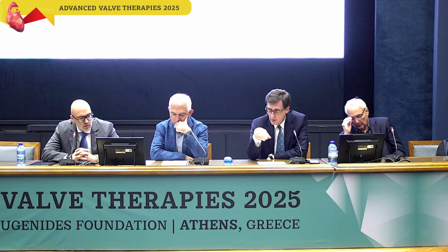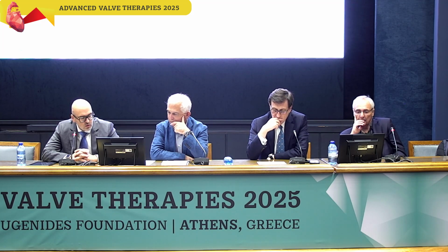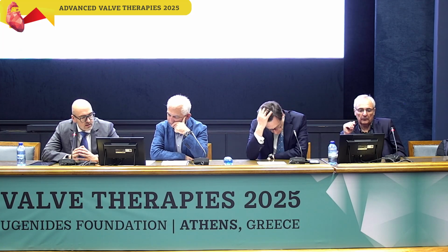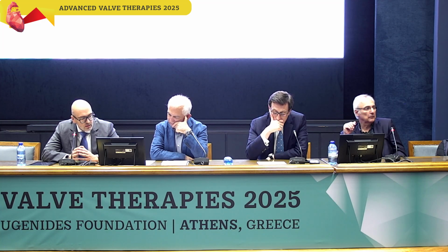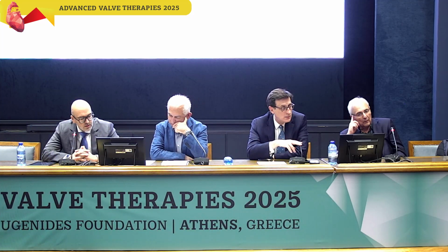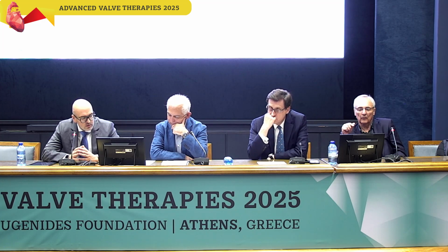One millimeter more or less doesn't make a big difference. So we have 22 here, so if you go with a 23 or 21 millimeter balloon, the first predilatation is okay. You have to avoid a bigger balloon because there are some cases in the bibliography with complications. So go close to the small diameter, plus or minus 1 millimeter, and you will have good results.